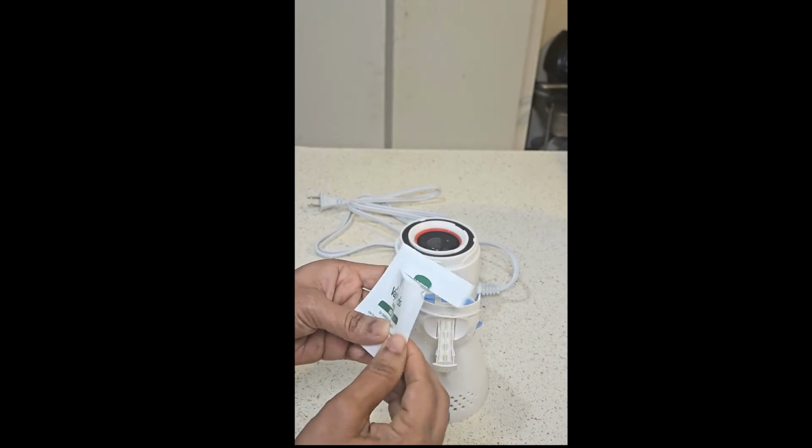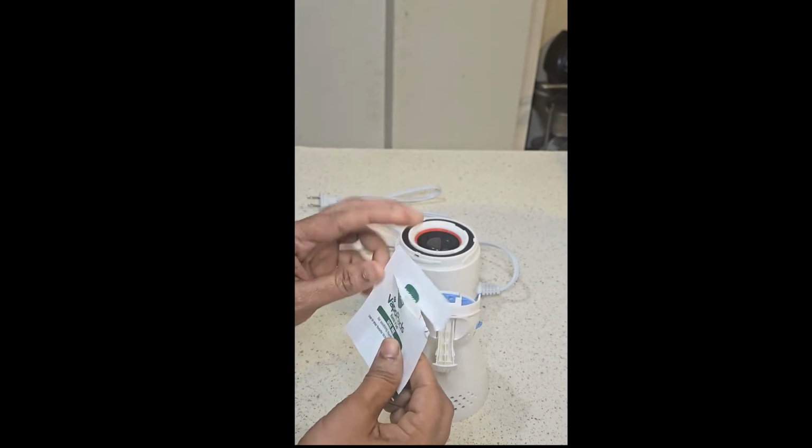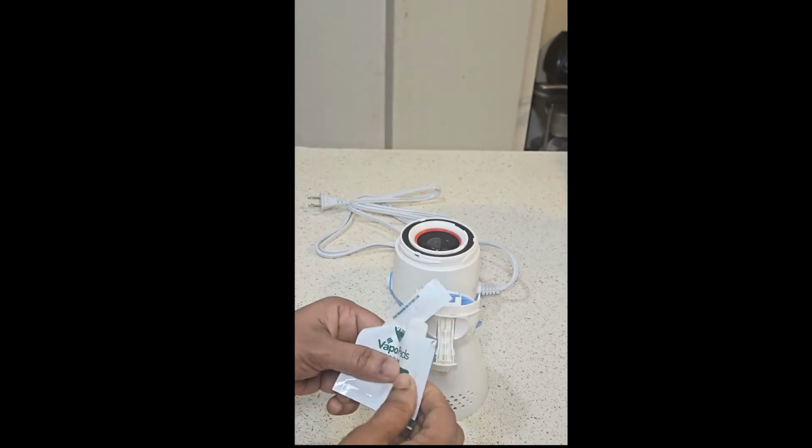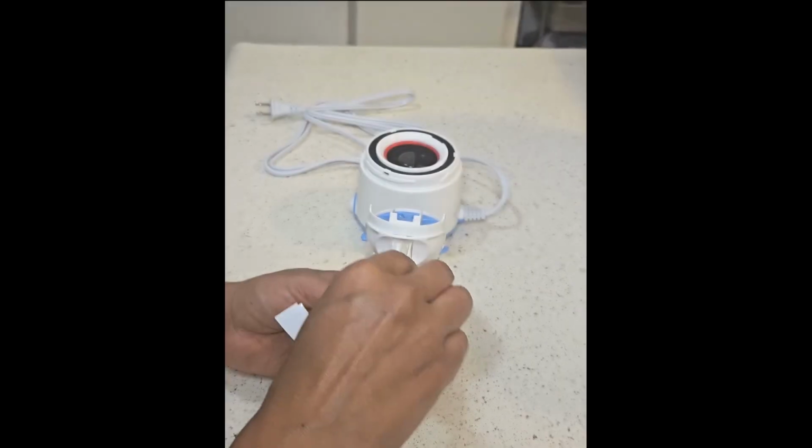Open VapoPad sachet by tearing notch on pad bag. Do not touch pad with hands. If pad is touched, do not rub face or eye as it may cause irritation.